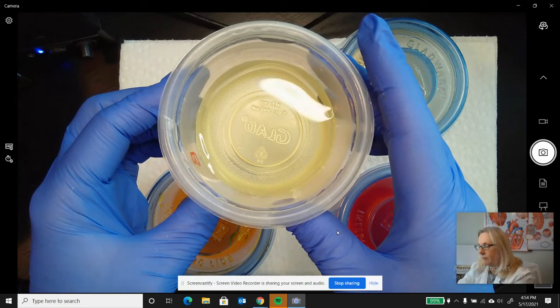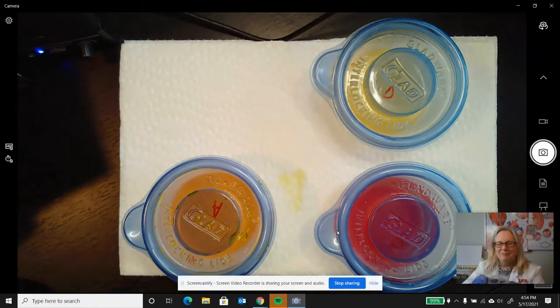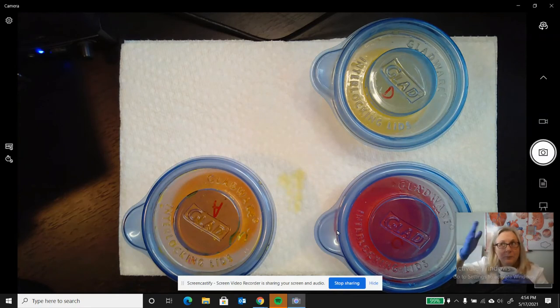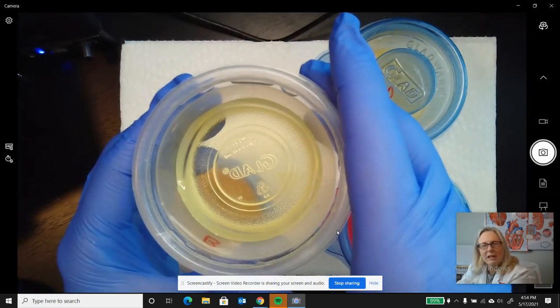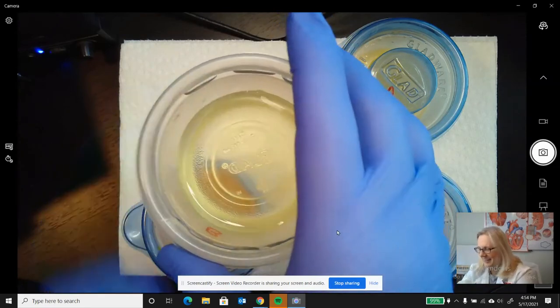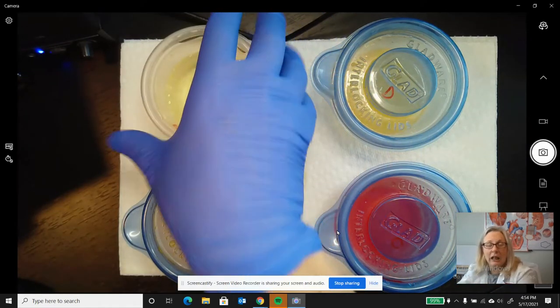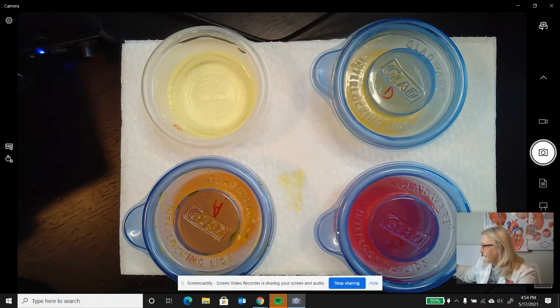Yep. Awesome. Here comes the smell, guys. Here we go. Wafting. It literally has no odor at all. Very little odor, if any at all. There is no odor for this one, which makes me happy as a person testing it. I could have said it had a light nutty odor, but it really doesn't have much odor at all. So that's good for this person.